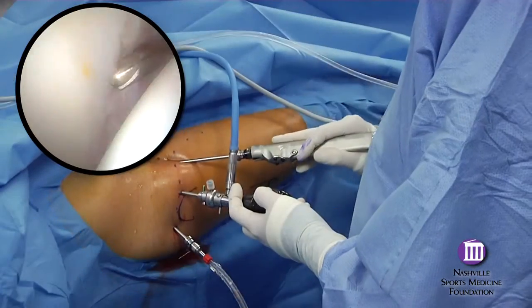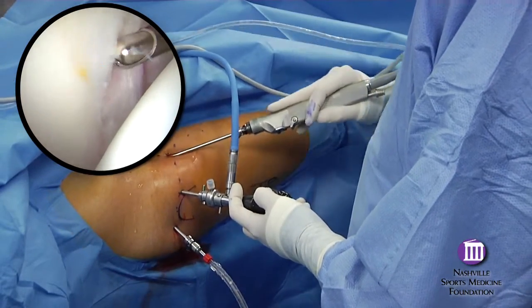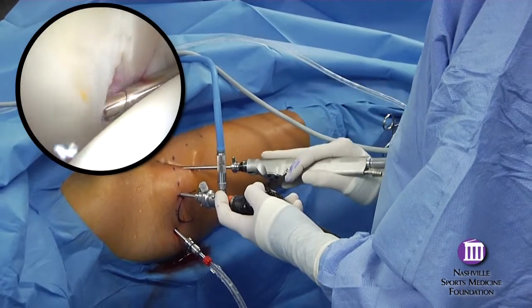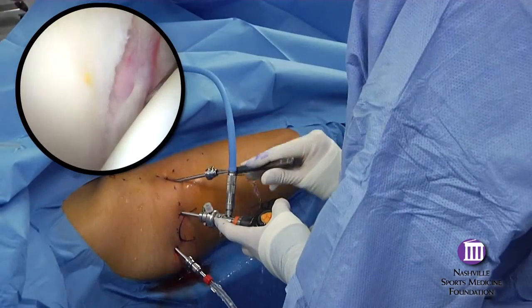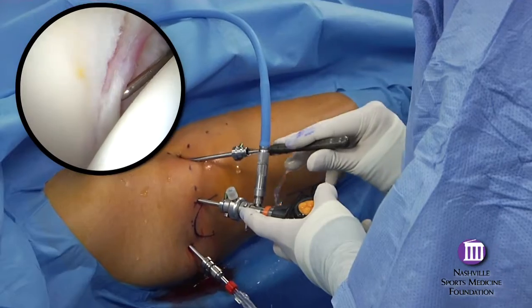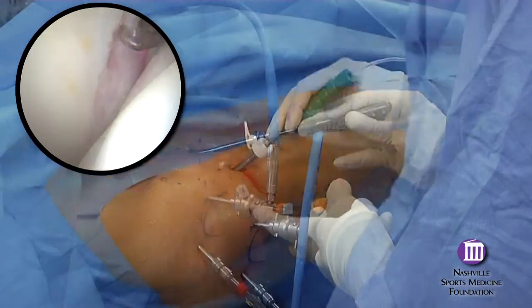In this case, the anterior rim of the acetabulum is being prepared to provide a fresh bony bed for the repair site. With the damaged portion removed, sufficient quality labrum remains to warrant a primary repair.